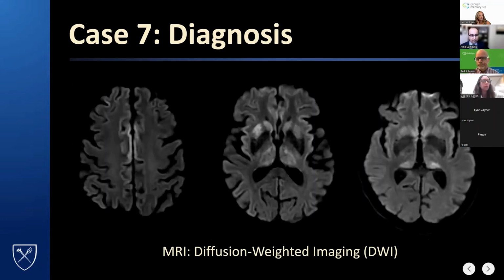And I think maybe one of the take homes from this that I'd like to impress on everyone is the more information we get coming in, the better and more helpful we can be as radiologists. So it's rare that we're going to get periodic sharp waves on EEG. We're looking for CJD, but if we got that, we would be very much more highly attuned to this.